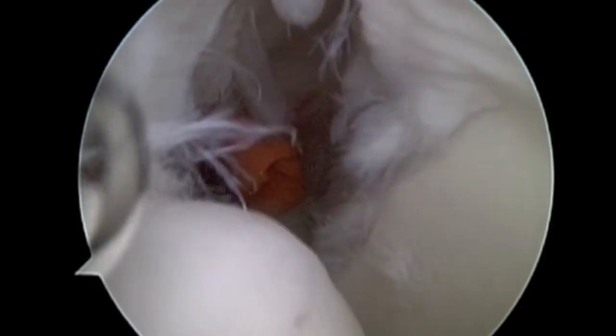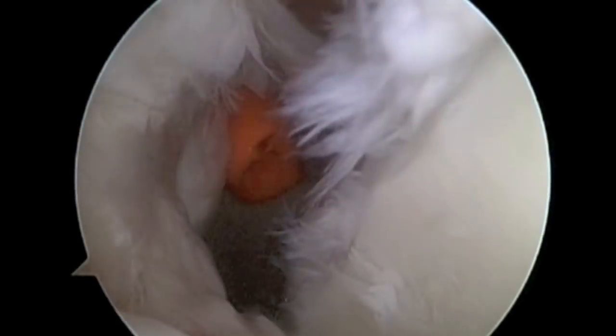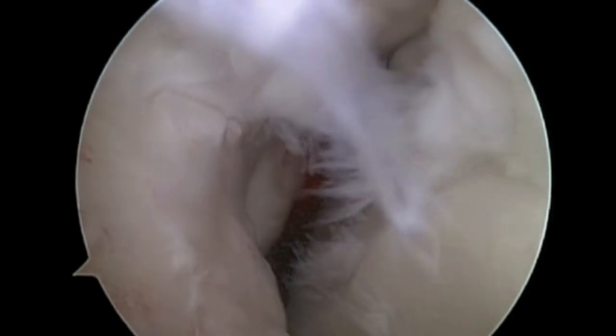We're now viewing this from the front of the shoulder. The partial tear of the rotator cuff is to the left and the tear of the labrum is to the right.